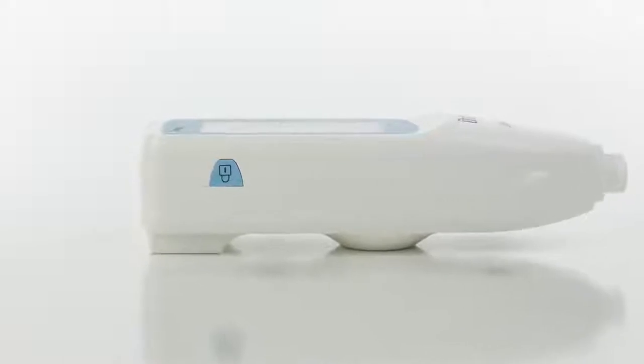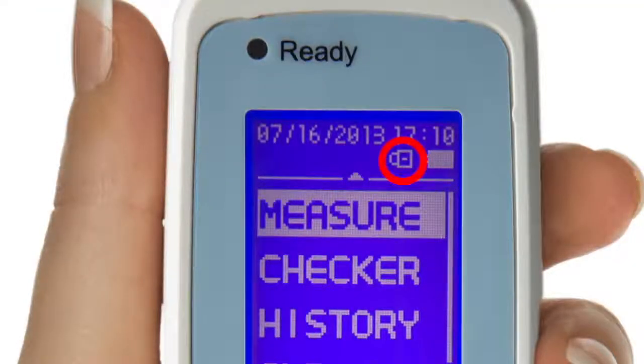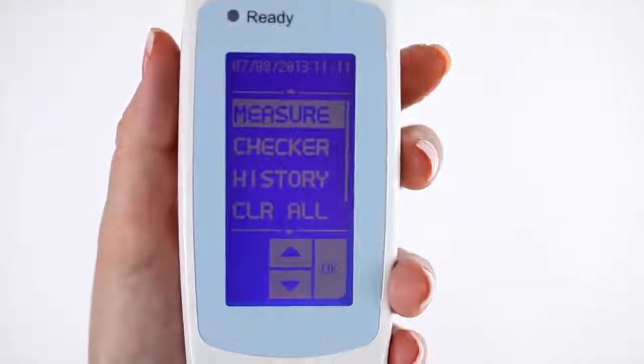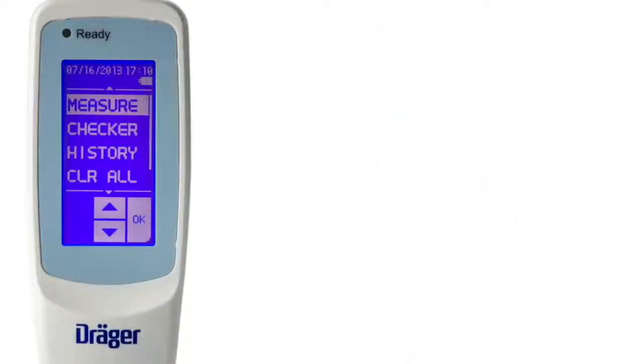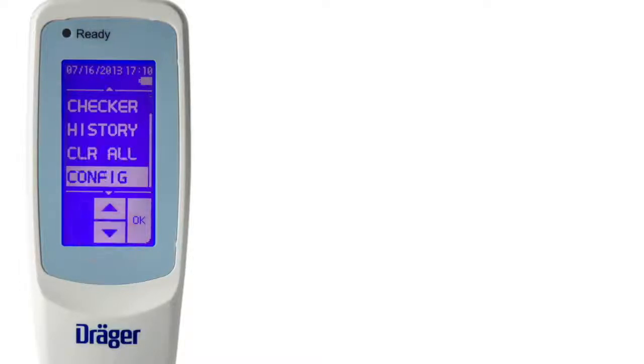On the opposite side of the JM105 is a blue screen lock button. When pressed, a lock symbol appears in the display and the touchscreen of the JM105 cannot be used. Make sure the lock symbol is not present before attempting to use the JM105. A touchscreen display allows the user to take a measurement, check the device, or access the menu to configure the JM105 for use in your clinic or hospital.